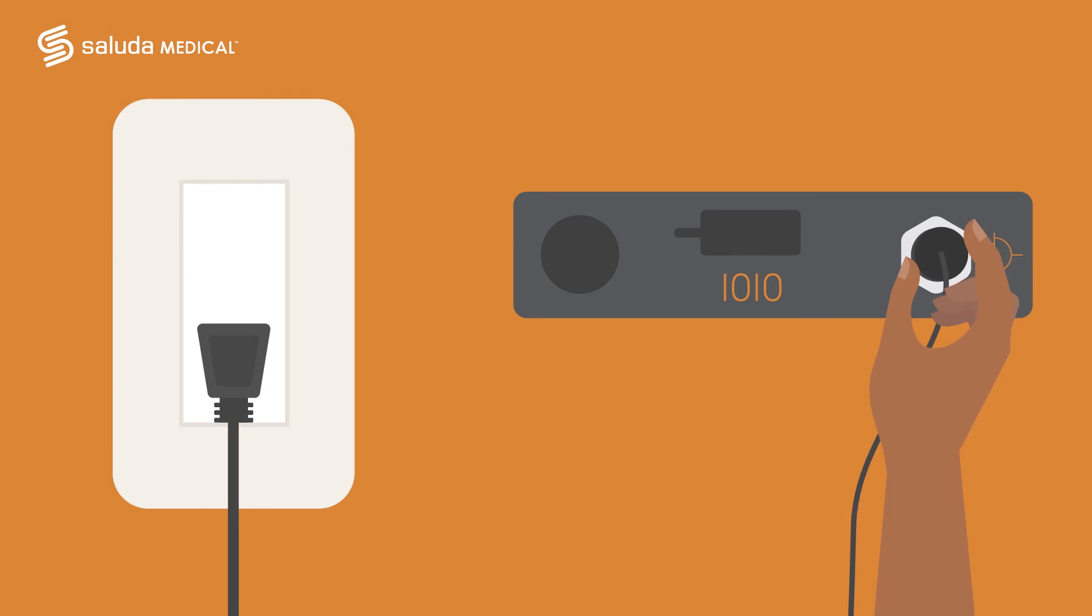Unplug the charger from the power adapter. You will not be able to charge your device while the charger is plugged into the wall.